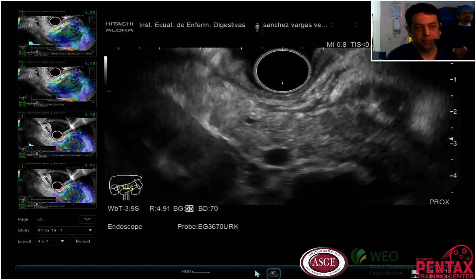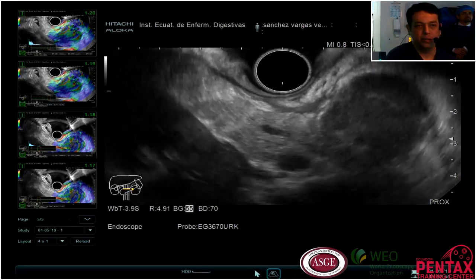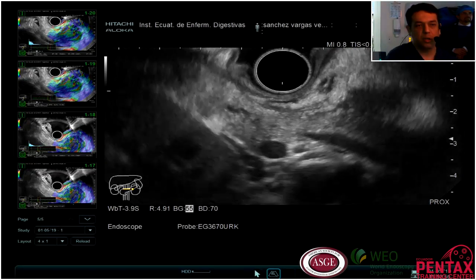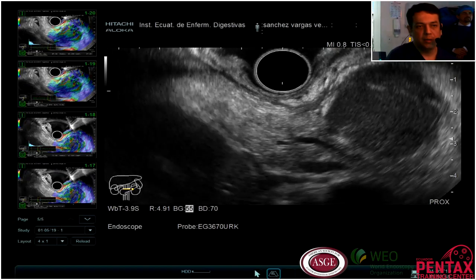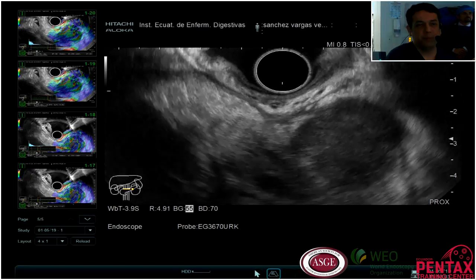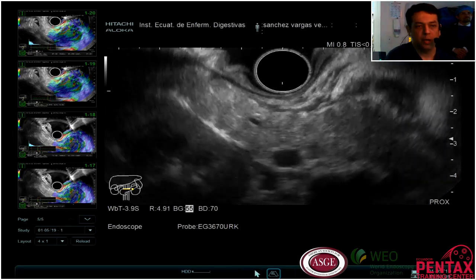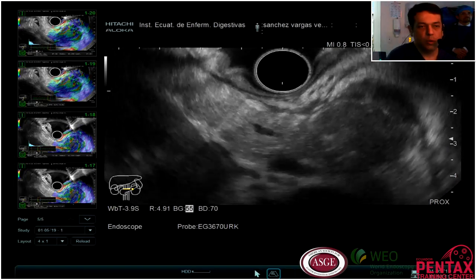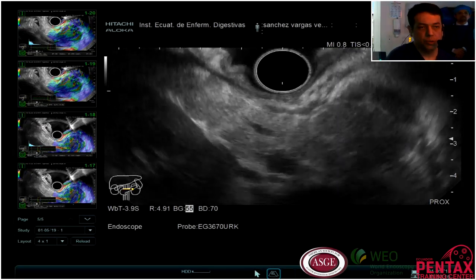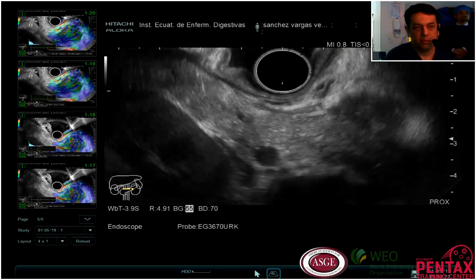So the situation is that we don't know very well the clinical history of this patient, and there are some situations that I need to evaluate very well before taking a decision. I am working today with a Pentax scope and an ultrasound machine Arietta 70.